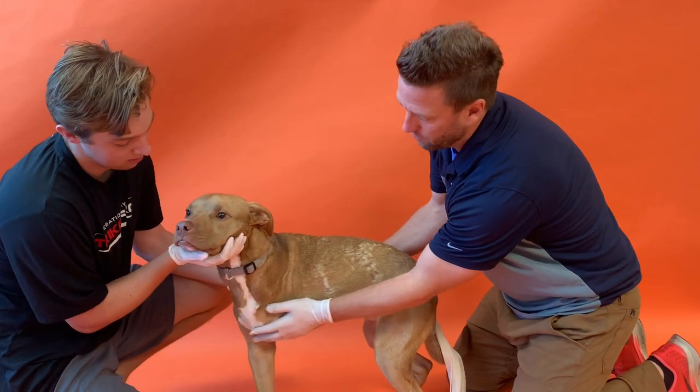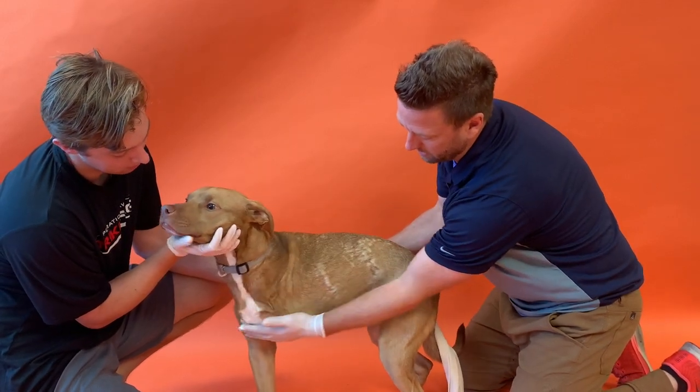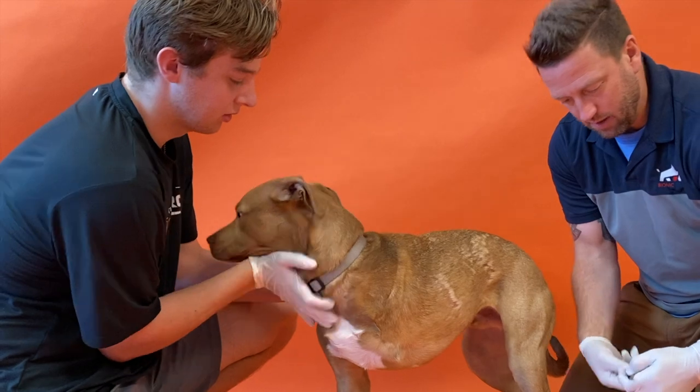The kit also includes a clever cutter and a pair of scissors. Today we're going to do a casting procedure for a full limb prosthesis. Cooper here has no shoulder blade or anything remaining, so it's a nice clean amputation.